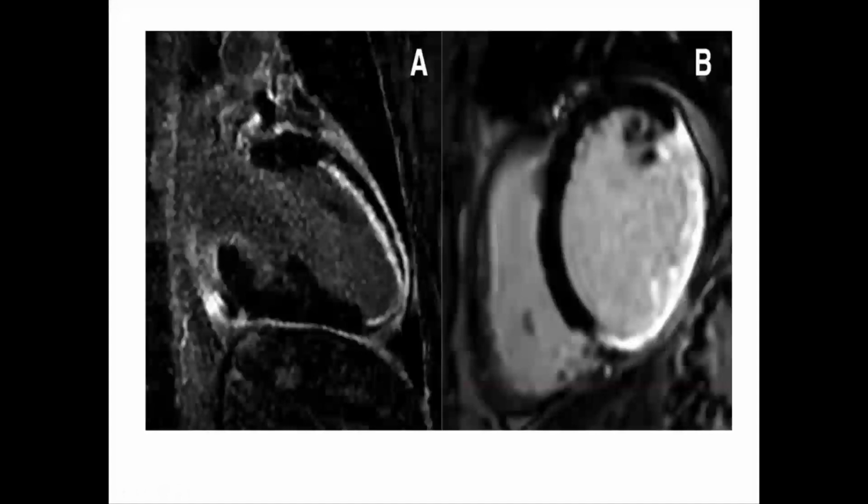It's important in cardiac MRI to differentiate between what is called subendocardial scar or fibrosis and transmural. So this is transmural, taking the whole thickness, and this is subendocardial, where you still see some myocardium. And this is important because in subendocardial scar, these patients will benefit from revascularization. If the patient has transmural scar, there is no hope for this patient, and this cannot be provided except by cardiac MRI.